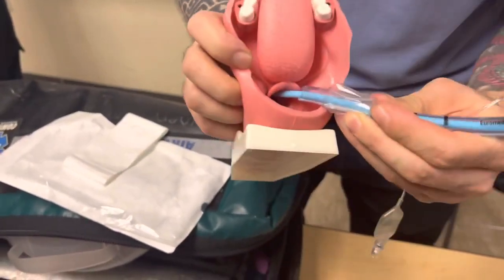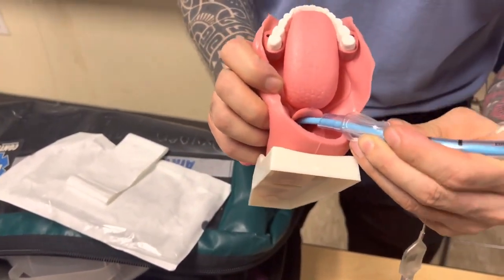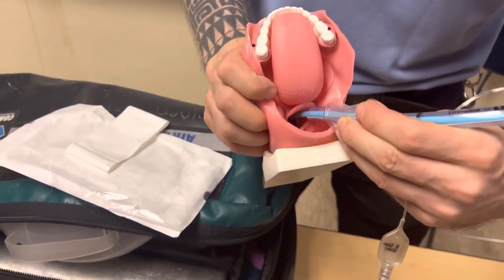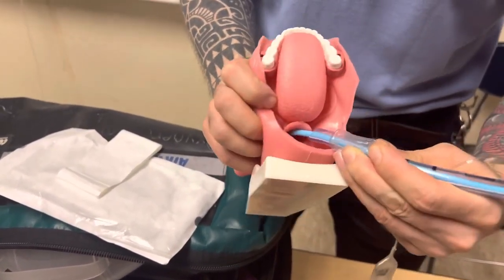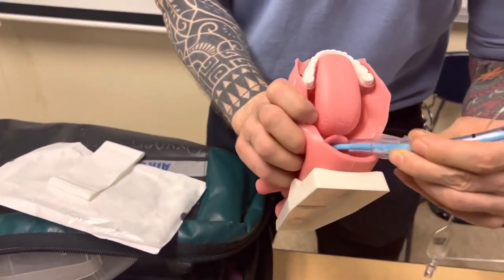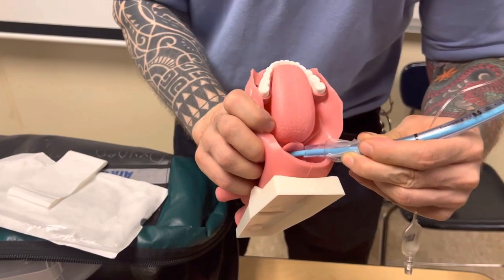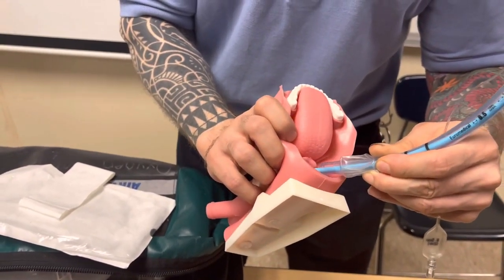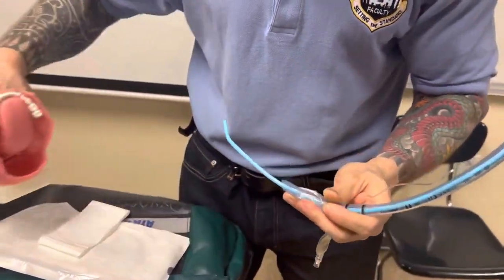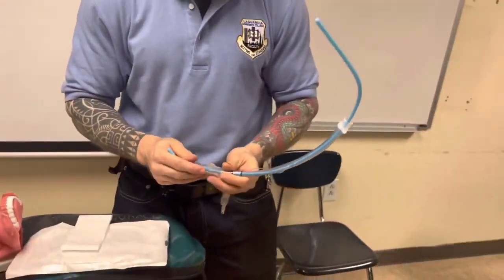If this occurs and the bevel gets caught, you're going to rotate the tube counterclockwise, like this. So the bevel goes up, and then you'll be able to advance. Everybody see that? If you're feeling hold up and it's not going through, pull back, rotate, and then it's going to advance forward. This is what usually happens. So hopefully that was clear.